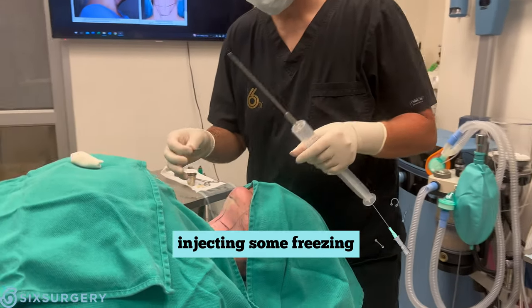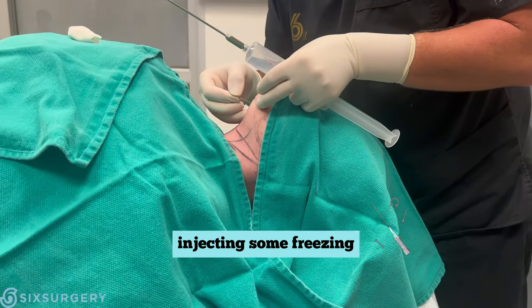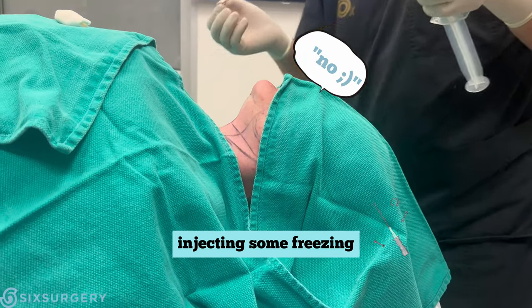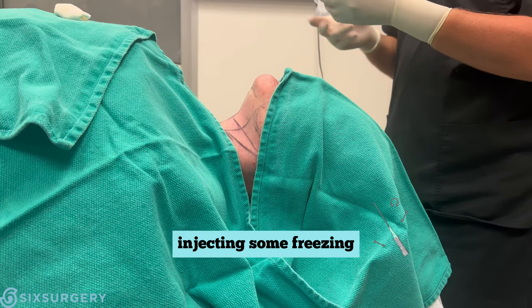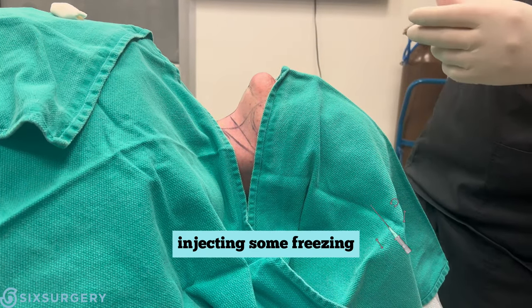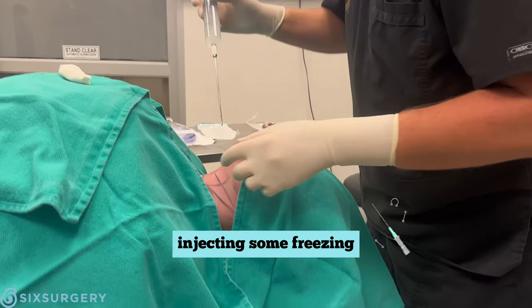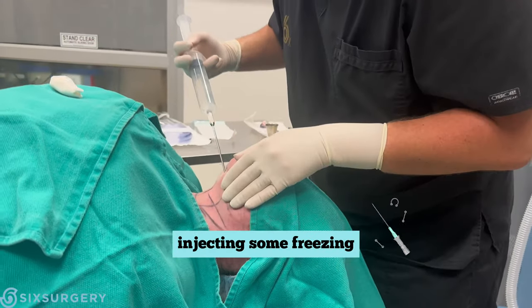So we've prepped. I'm going to make a small stab incision underneath the chin — one, two, three, poke. It's all frozen. Did you feel anything? No. Now I'm going to inject more numbing solution all over the area using a blunt cannula — nothing sharp — injecting all along the marked areas to freeze them.